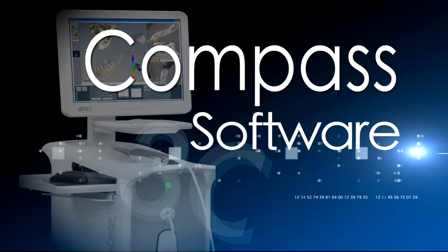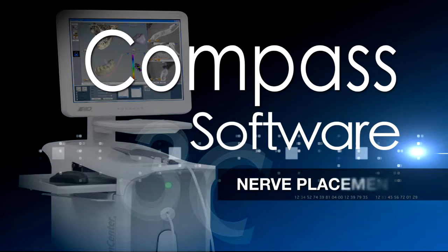So I've asked our good friend Glen Freeman with D4D Technologies to join us today to show us the new features associated with the integration between Compass and E4D software. Glen, welcome. All right, Alex.